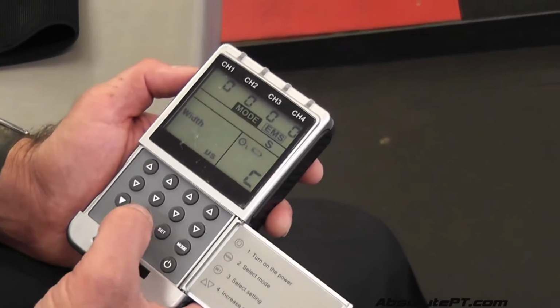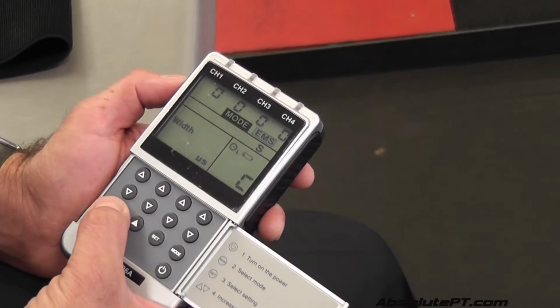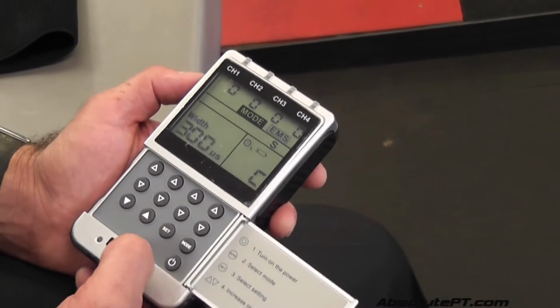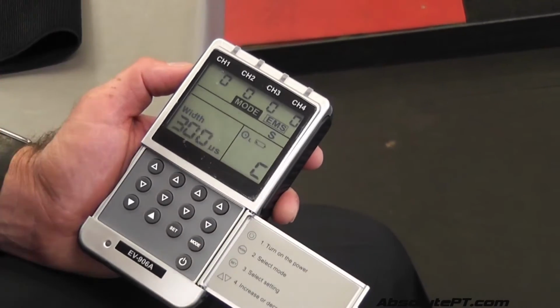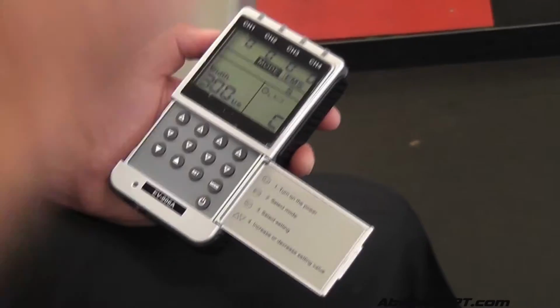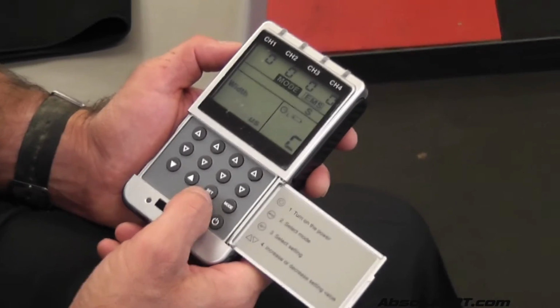Width, okay, 300 is the max. If it went higher, I would go higher, but 300 is pretty good. It's a pretty powerful machine. But that's 300 microseconds. That's how long your pulse width is, which you combine with amplitude, how many milliamps you use, and that gives you how powerful your stimulation is.